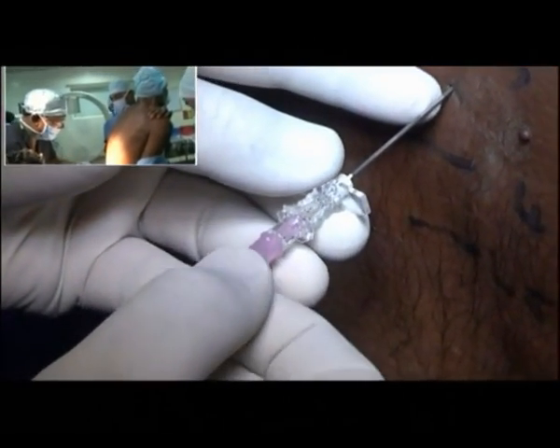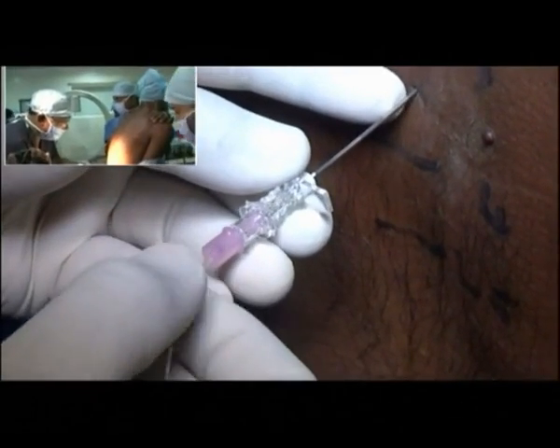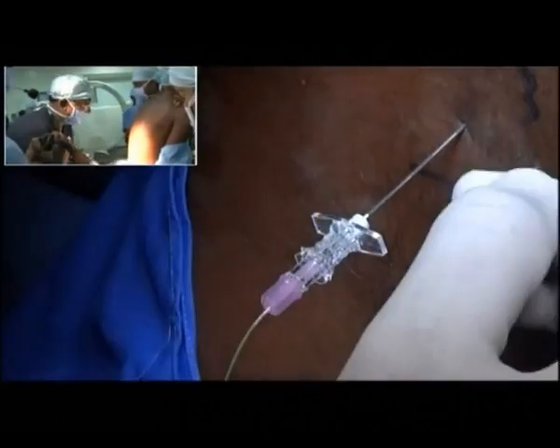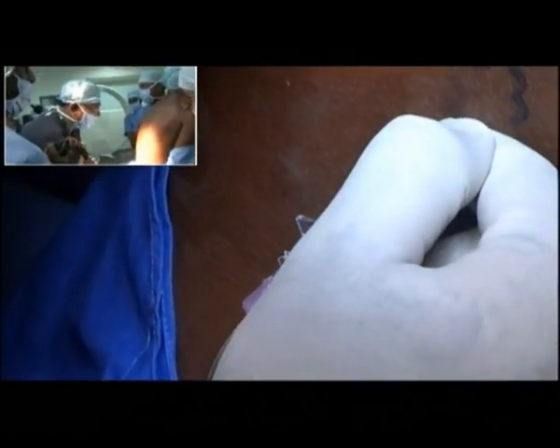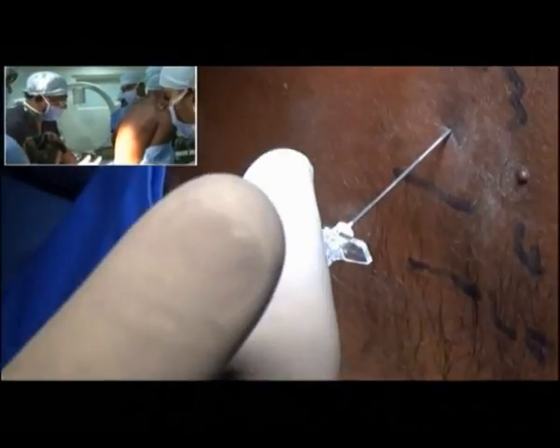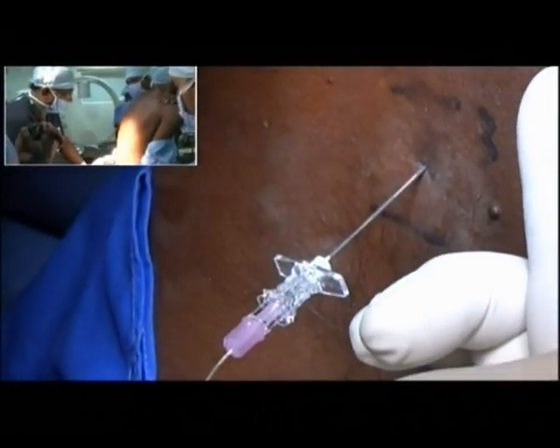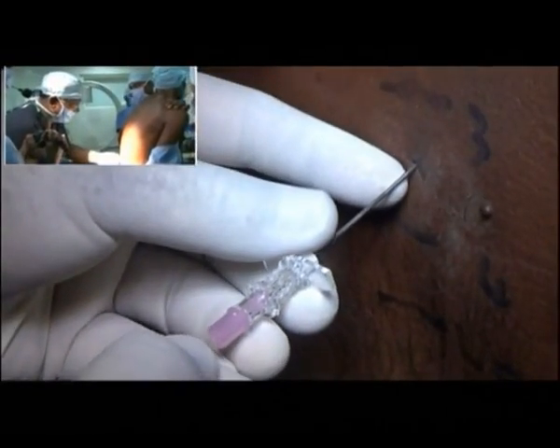The catheter is also being threaded comfortably. See, 1, 2, 3, 4, 4.5, 5.5, 6.5. We have got this space at 3.5 centimeters. We are going to place the catheter in by about 3 to 4 centimeters. So at 6.5 or 7 centimeters, we fix the catheter at the skin level.